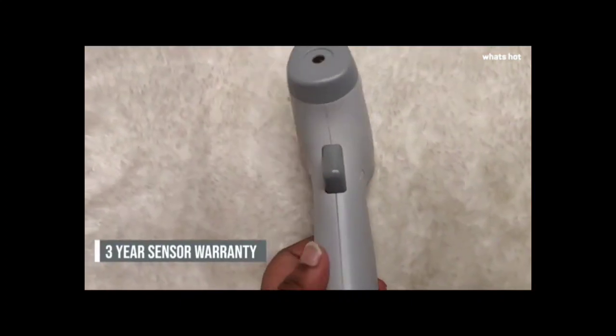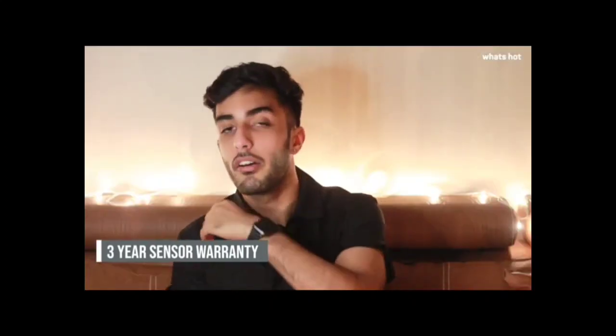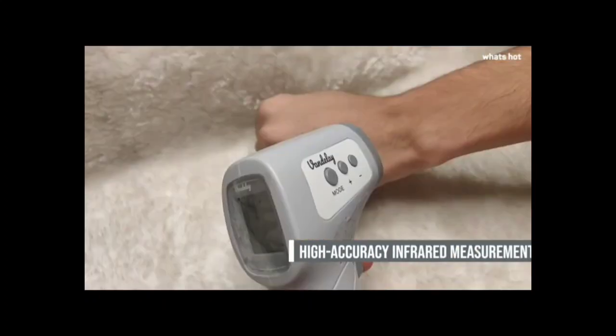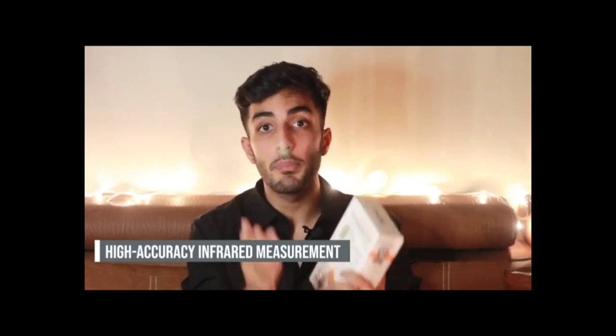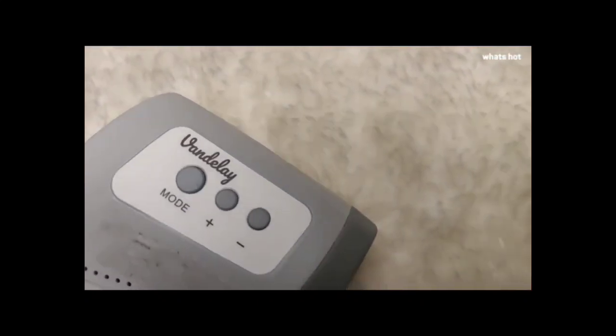With the pandemic locking us all in our own places and keeping us aloof from our friends and our loved ones, the non-contact option helps us to be safe and enjoy our share of fun. This allows us to meet one another responsibly. Apart from personal reasons, even if you are an employer, it is an important investment for the welfare and the safety of your employees.